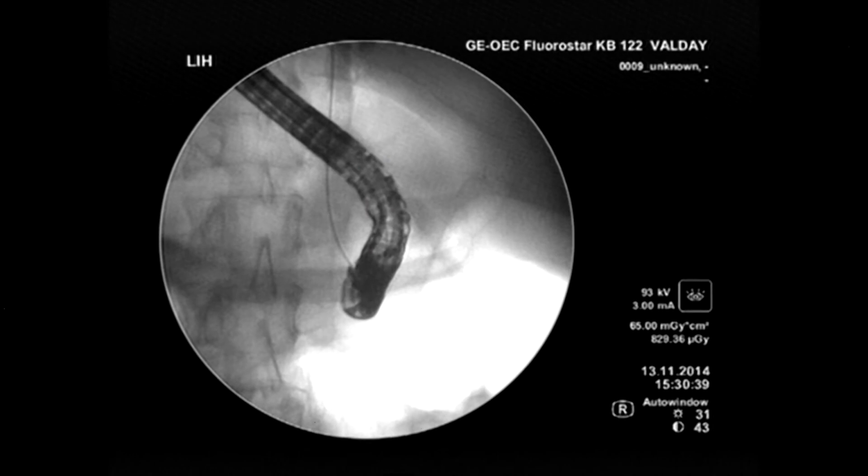The wire, of course, has no function as a Seldinger wire now because the forceps is not an over-the-wire thing, but it's good to see where we're going. And I'll always get a good impression whether I'm in the common bile duct or in the pancreatic duct, which might happen as well. And taking biopsies from the pancreatic duct will result in massive bleeding and, of course, pancreatitis afterwards.